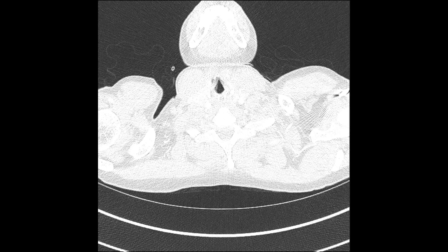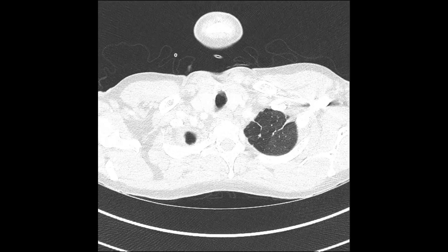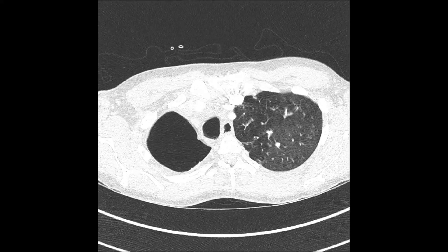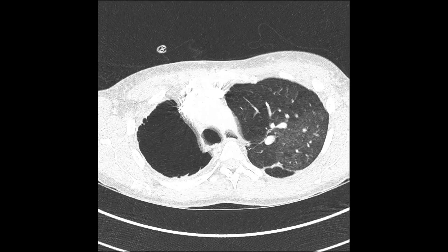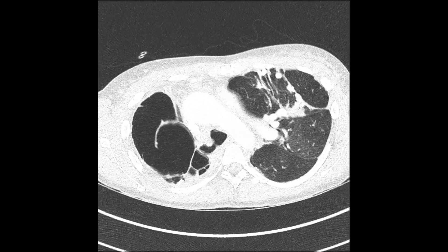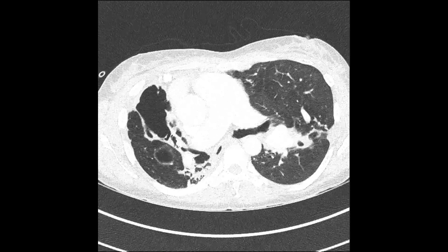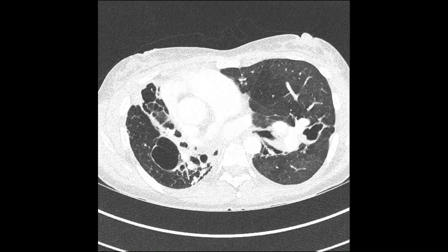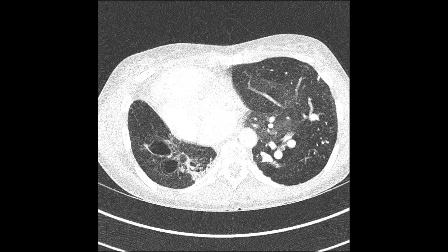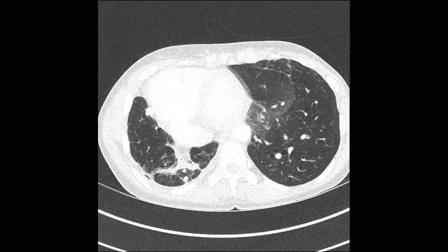You can also see a volume increase of the remaining aerated right lower lobe, which could reflect increased air trapping. The pattern of bronchiectasis with air trapping is seen throughout the lungs, and there is a degree of atelectasis and calcification in the left lung.